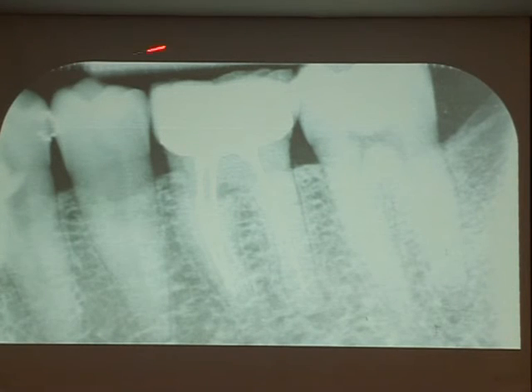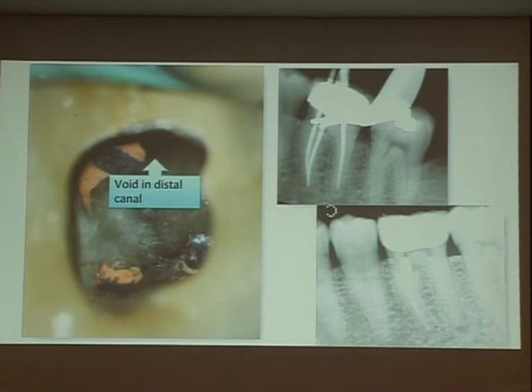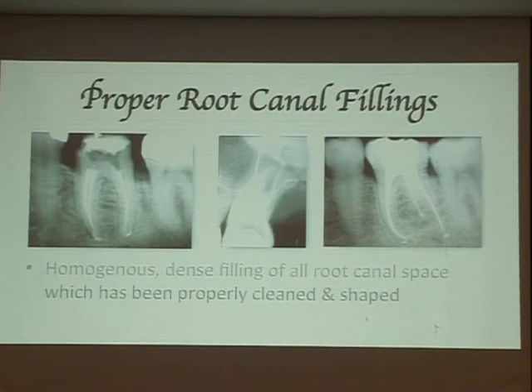So this is a case, a lawyer came to me and said, I got a root canal done recently. He's a lawyer, okay? So you need to be careful. The dentist did it twice, still in pain. I took a cone-beam CT, 3 roots, 3 canals, I said fine, except a little bit of an area. Later you come back for retreatment. Okay, sorry. So I found a void in the root filling. It's not shown in the cone-beam CT. And I retreated it and it's okay.